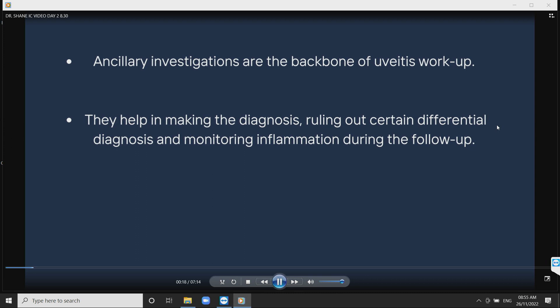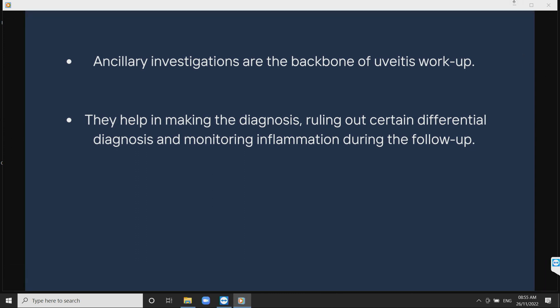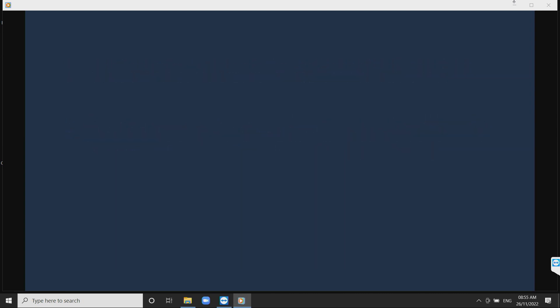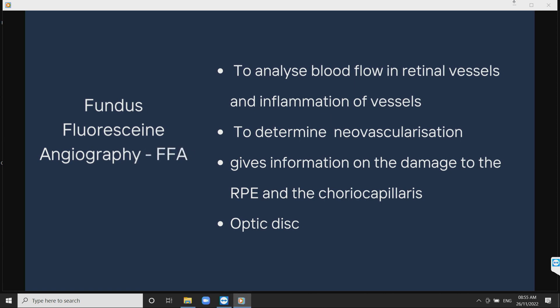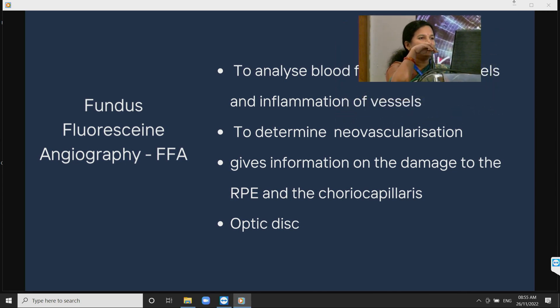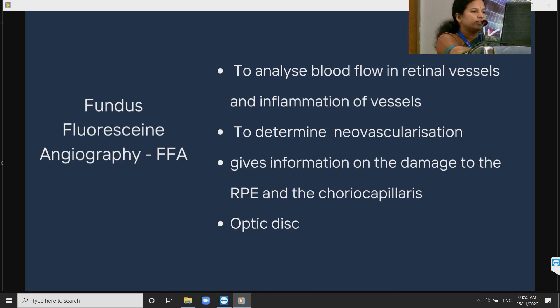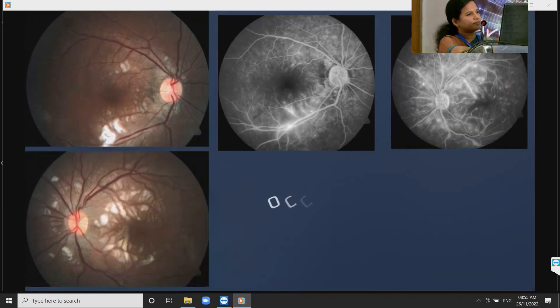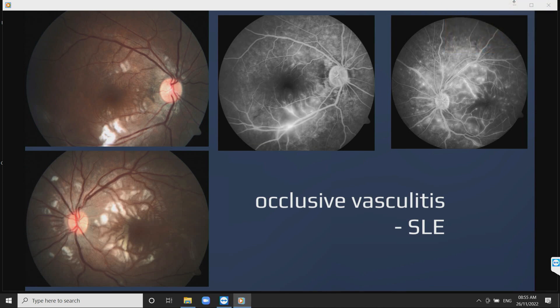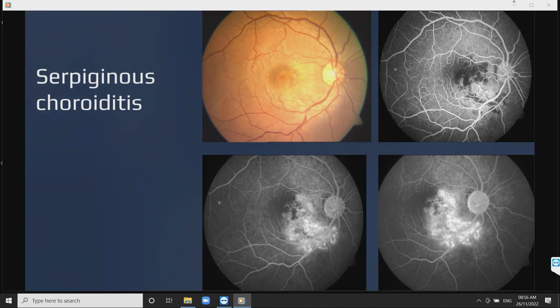Ancillary investigations are the backbone of uveitis workup. They help in making the diagnosis, ruling out differential diagnoses, and monitoring inflammation during follow-up. FFA helps analyze blood flow in retinal vessels and detects vascular inflammation, neovascularization, and gives information regarding the RPE and choriocapillaris. It also gives an idea about the optic disc condition. This is an example of occlusive vasculitis — FFA gives a complete idea about the extent of vasculitis and the ischemic status of the retina.